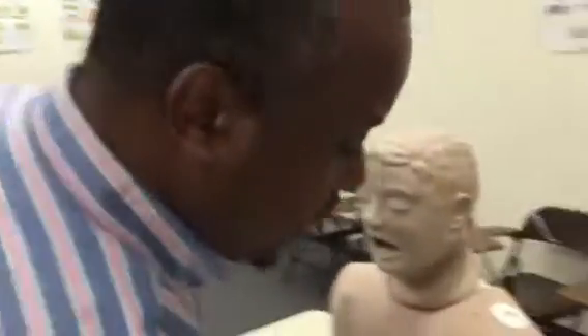Today we're just going to do a brief tutorial video on how to intubate a patient in a sitting and standing position. We're already going to assume that this patient has been pre-oxygenated, hyperventilated, and given one to two milligrams of Versed to sedate the patient and facilitate intubation.